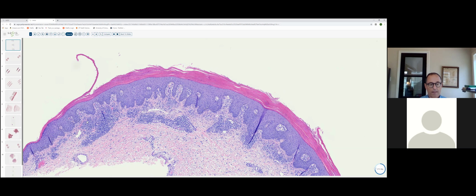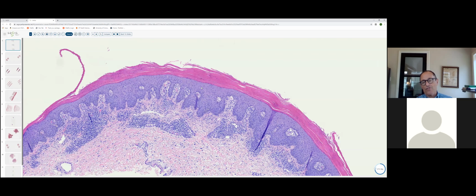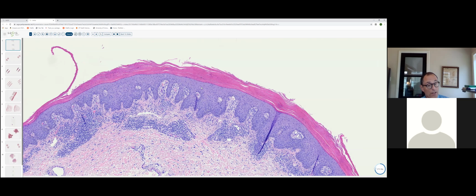They're pruritic, patients tend to itch them, and so over time they become more irregularly hyperplastic. With a chronic eczematous dermatitis, you can get parakeratosis within the stratum corneum, but typically you see serum admixed with the parakeratosis. So rather than having dry scale, you'll have parakeratosis, serum, and frequently neutrophils.